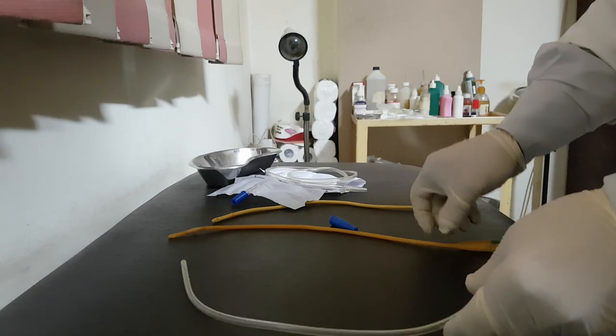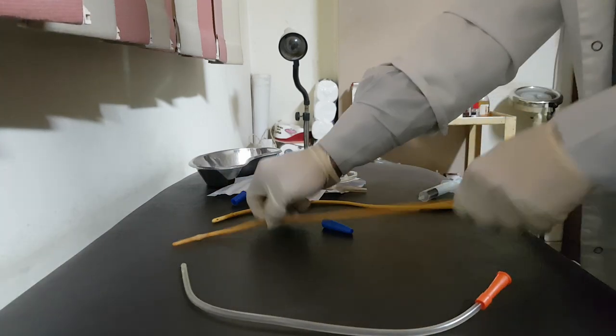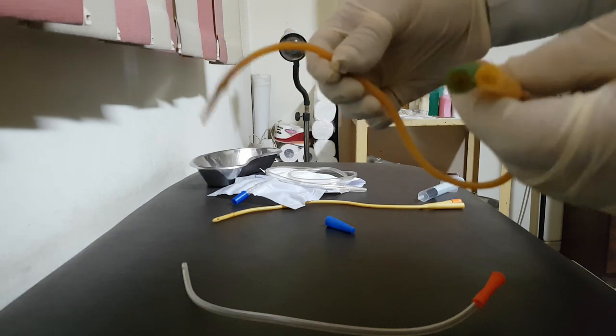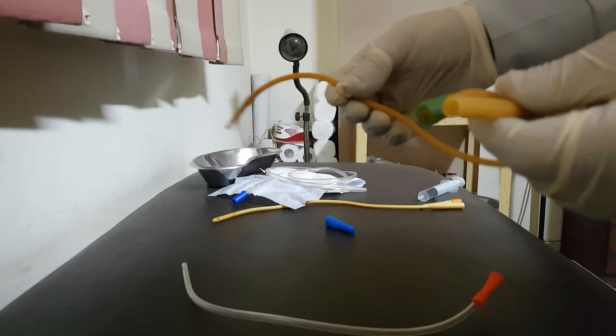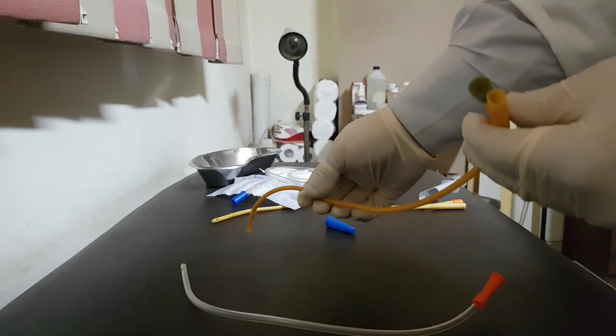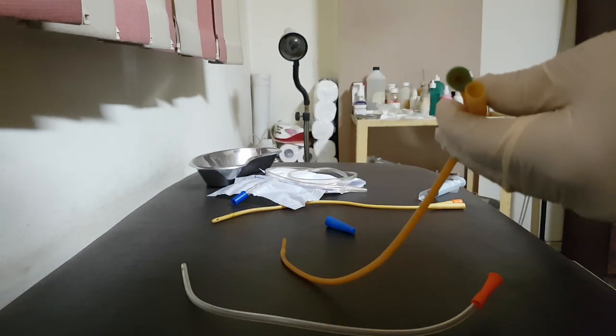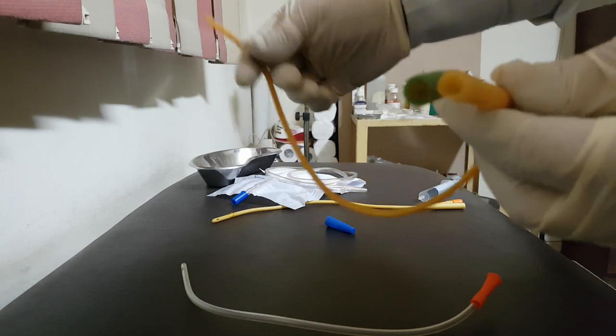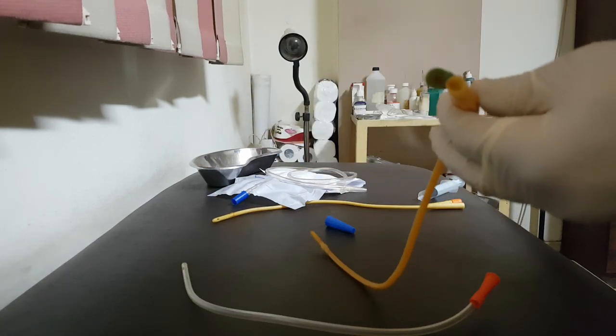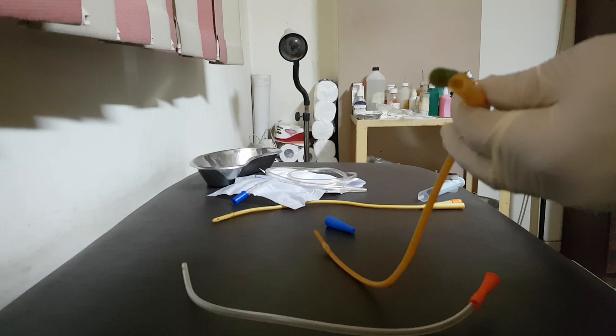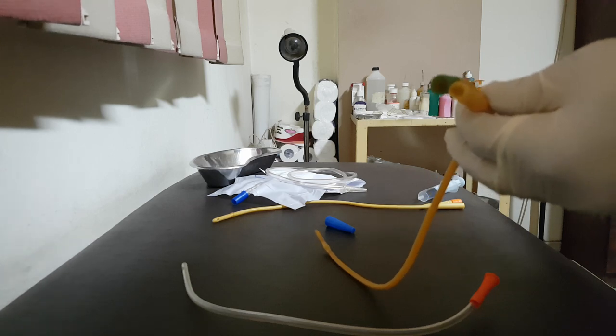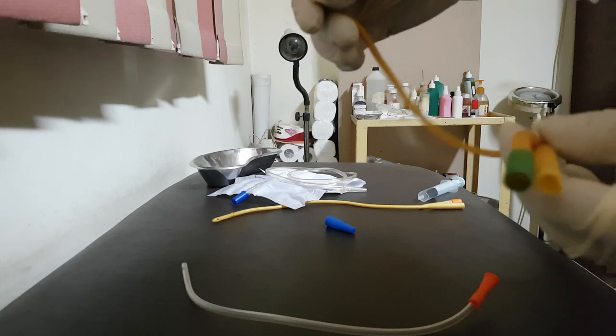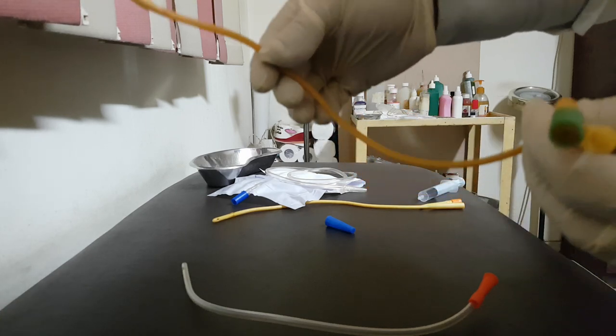This is what's called the intermittent catheter, Nelaton catheter. The other example is Foley catheter. Foley catheter, this is under the category of indwelling catheter. Indwelling catheter includes two main important items: either Foley catheter or silicone catheter or suprapubic catheter, which is inserted suprapubically through a minor surgery inside the bladder. But this Foley catheter is inserted through the urethra.